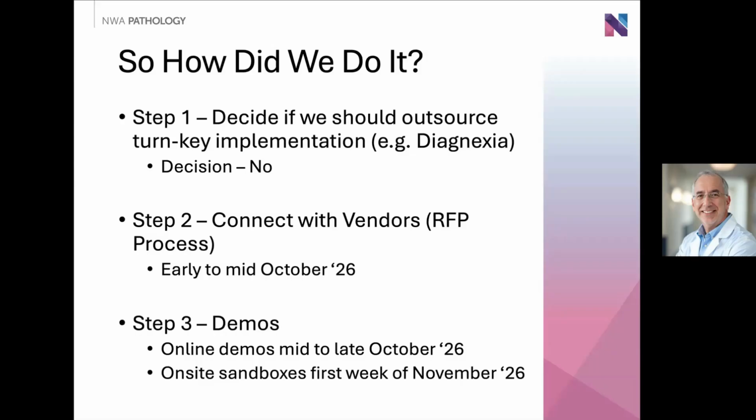As we evaluated how much additional effort it would take to move beyond that limited launch and implement a full in-house digital pathology system, we realized the lift was not dramatically greater. Because our medium to long-term goals around AI implementation, workload efficiency, and recruiting remained unchanged, we decided to accelerate our timeline, moving ahead roughly 2 to 3 years earlier than we had originally anticipated.